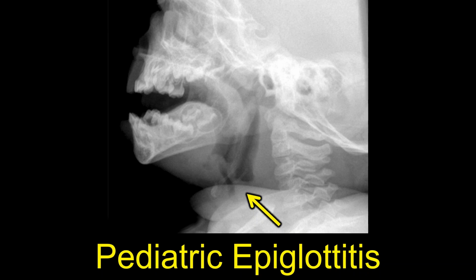Usually we're always talking about CT and MRI. Ultrasound is great for its portable technique as long as you're familiar with evaluating the echogenicity of different structures. But this is one of the few places where we sometimes use plain film.